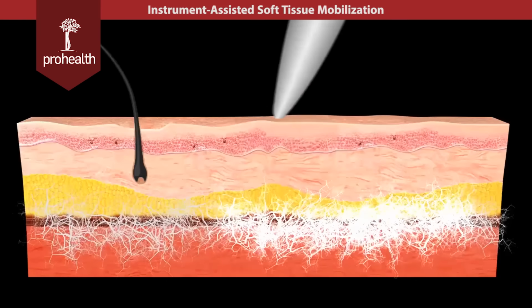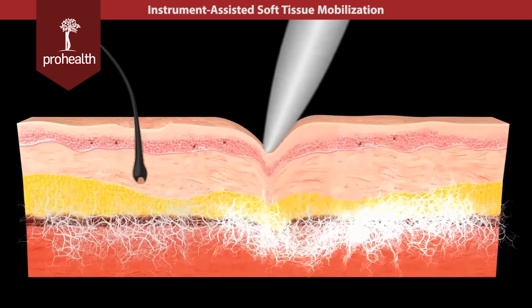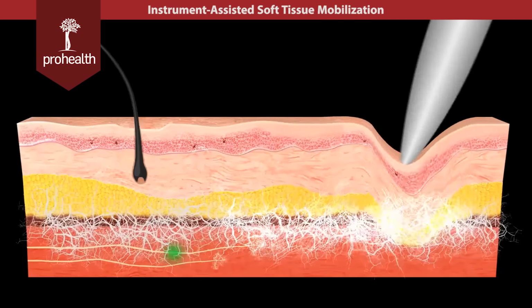Practitioners appreciate the use of IASTM for the relatively short treatment times required and decreased wear and tear on their own bodies. The use of beveled instruments allows for deeper, more specific treatments and adds another tool in the toolbox of any practitioner.